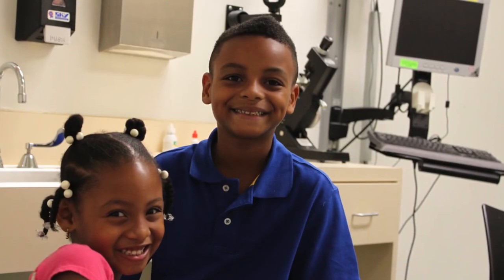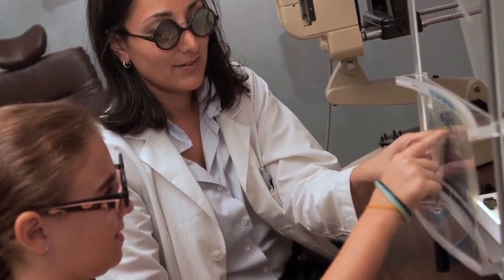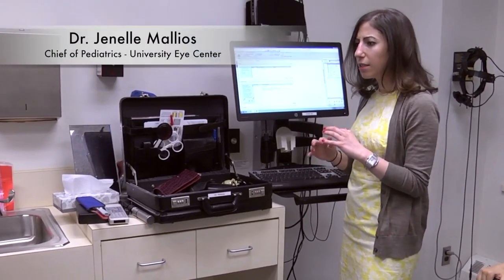A pediatric exam is very different than an adult eye exam. And in this video, we'll show you the different steps that happen during a pediatric exam. The first thing that happens is a case history.